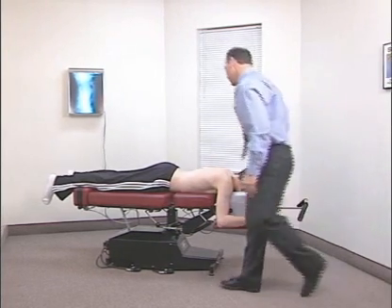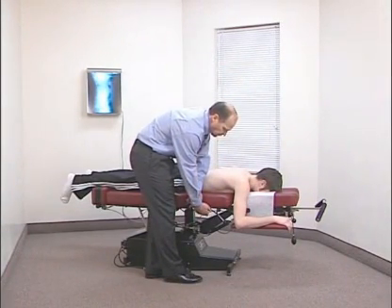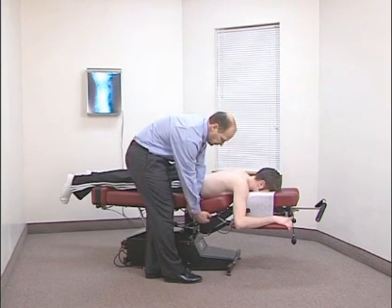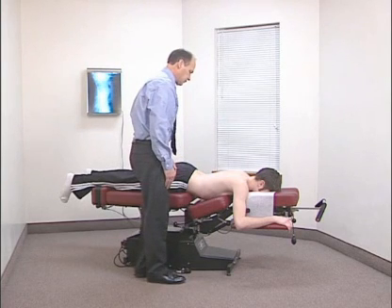Grasp the abdominal section under the back edge with your right hand, and with the left hand, release the abdominal lock to lower the abdominal section. Slowly guide the abdominal section down until it stops. Do not lower this section fast. Abdominal weight will cause the section to drop too rapidly, causing lumbar sprain strain. Lowering the middle section allows for the lumbar spine to be in a normal lordosis for joint movement.